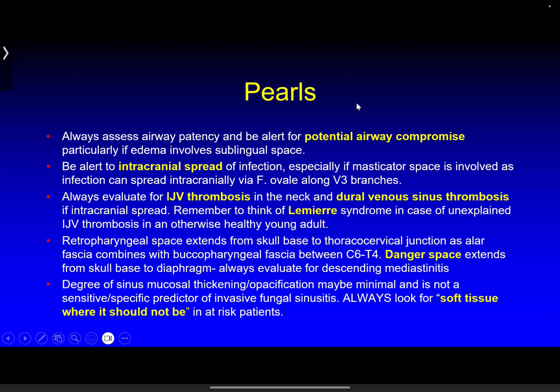The first question is, is phlegmon the same as fluid collection, and do we use this term? Okay, that's a good question. A phlegmon is not the same as a fluid collection. When I see just enhancing, ill-defined soft tissue, that is the stage of a phlegmon. When a fluid collection forms with a rim enhancement, it has progressed to an abscess. Of course, if you have a fluid collection without rim enhancement, it could be just a reactive effusion.